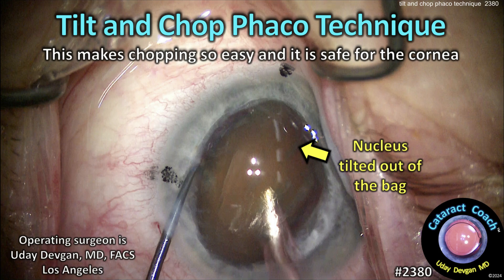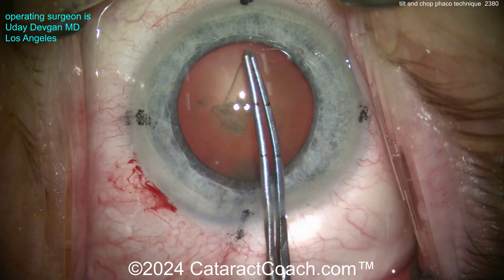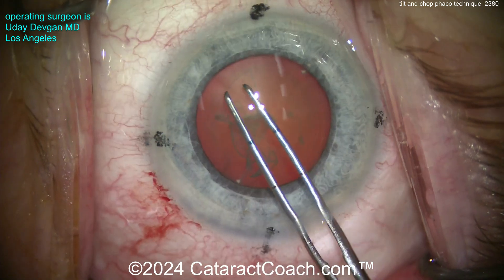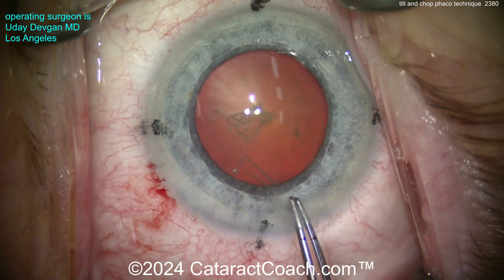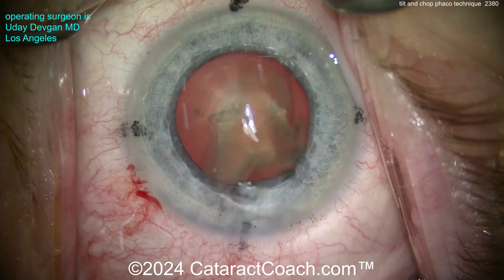Cataractcoach.com tilt and chop phaco technique — this makes chopping so easy and it's safe for the cornea. We'll first start off with a big capsulorhexis; it has to be at least five millimeters. In this case we're going to use forceps to measure. I will make a five millimeter rhexis — look at this, measured, there it is.